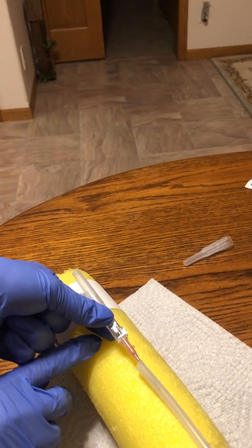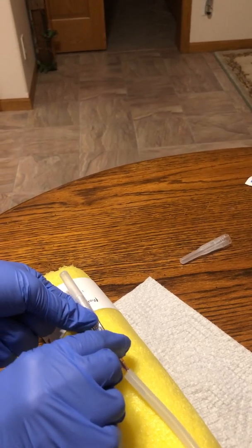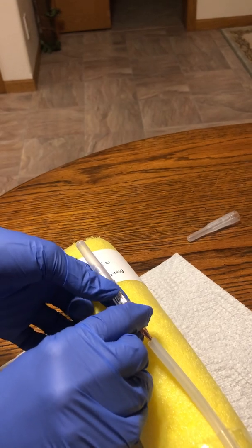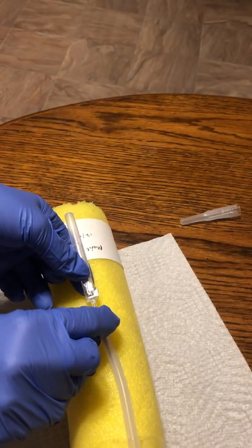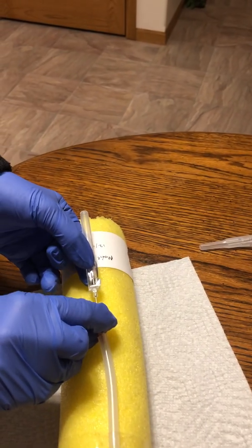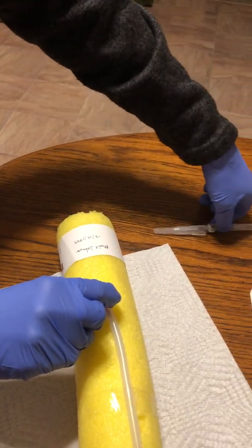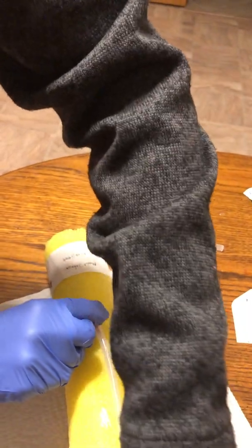And then once I'm done with that, I'm going to insert the catheter all the way into the vein. And next, I'm going to retract the needle, and then I'm going to take off the tourniquet.